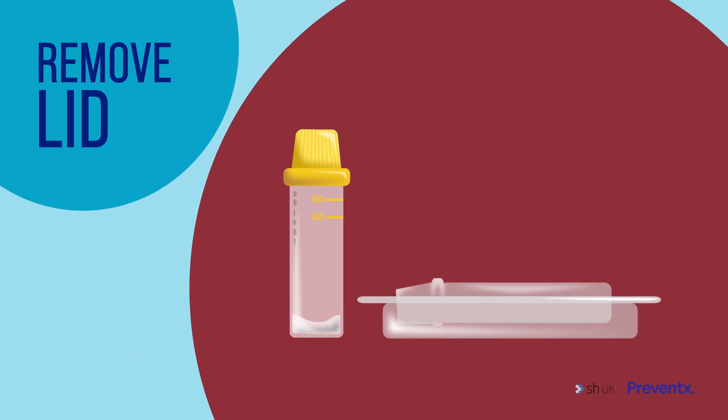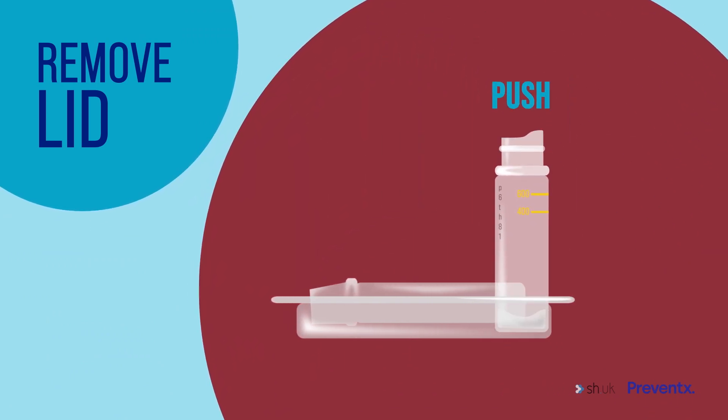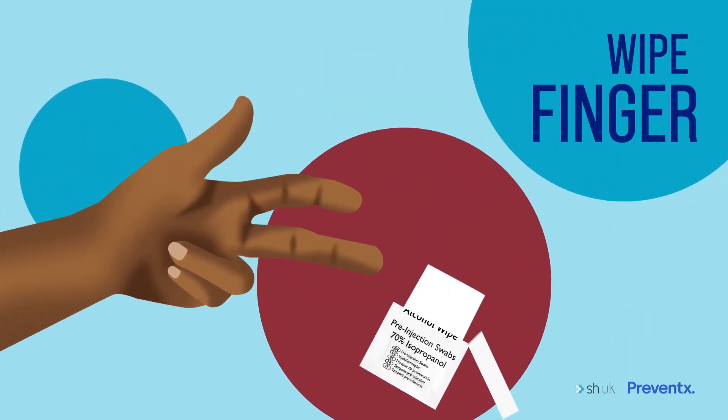Remove the lid from the tube and gently push the tube into the corner of the case so that it stands up. Wipe the end of your middle finger with the cleaning wipe. If you're right-handed, you may want to take the blood from a finger on your left hand, and vice versa.